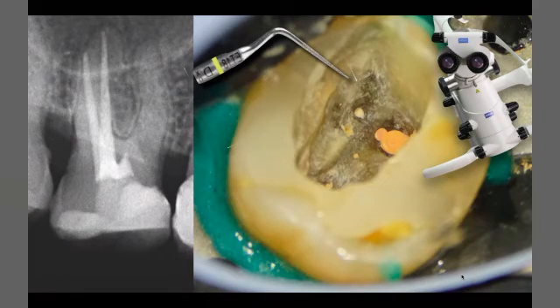So with more magnification, when you dry the pulp chamber after ultrasonic tip scrubbing on the mesial side, dry as much as you can, and you will see the root canal orifices clearly. Here is the MB1 and here is the MB2. Why? Because I have dark lines connecting the orifices. As we said, the floor map is the most important thing. Try to follow the dark lines, and you will catch the orifice.